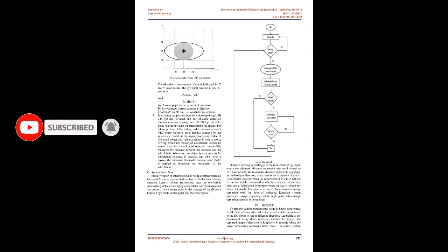The motor driving IC is controlled by using a 2-channel relay board, and a battery is used for the power supply. The motor driving circuit is integrated with the Arduino, which is connected to the Raspberry Pi, which helps to operate the system. The camera module and Raspberry Pi are directly connected to each other for continuous image capturing. The system generates the command signal to enable GPIO pins and to perform left, right, forward, backward and cease operations.